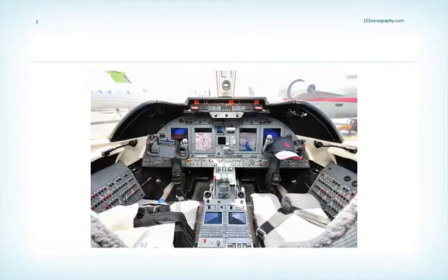This chapter deals with the question of how do we use the ultrasound machine and how do we acquire nice images in 2D. Now, the ultrasound machines often look very complex at the first glance, but in reality they are not really that complex. And you will, I'm sure, learn how to use the ultrasound machine quite quickly, especially since the ultrasound vendors often provide features which can really make it easy for you, such as buttons which you press which optimize the entire image. But still, you need to know at least some basics.